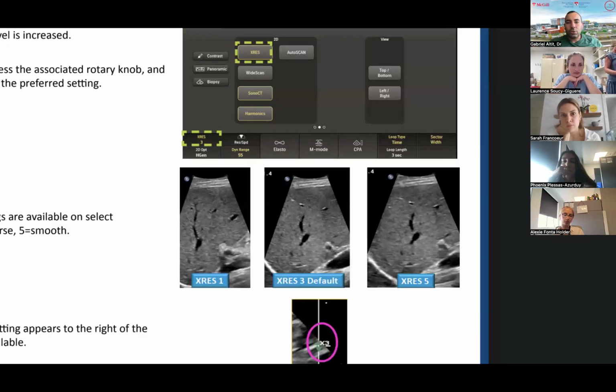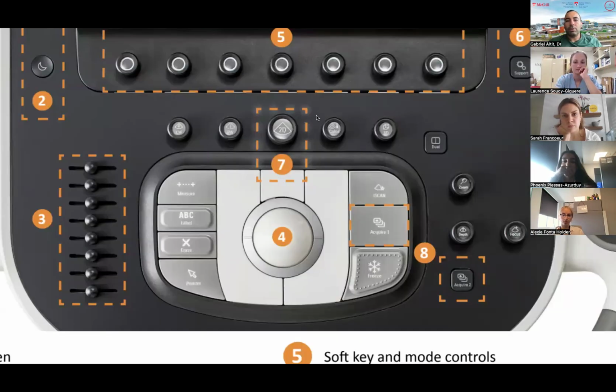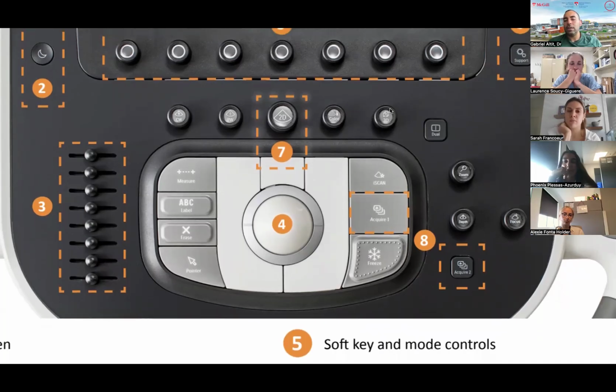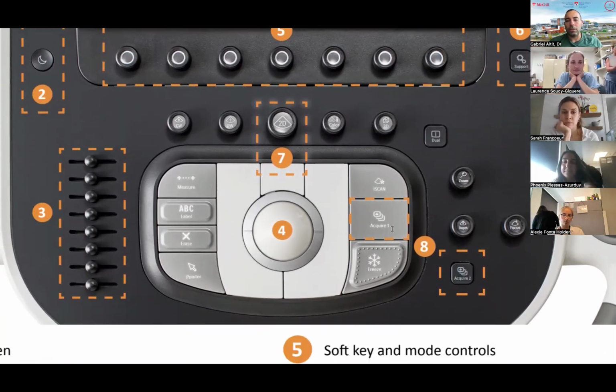So let's go back. We spoke about continuous wave Doppler, pulse wave Doppler. Color, as you know by convention, blue is away from the probe, red is towards the probe. 3D is only when you use an X probe, either the X7 or the X5. X5 for more adults, X7 for pediatrics. It's mostly to obtain volumes that we do that because we're looking at the functional parts. In the congenital ward, they're going to use a lot of that for the valvular anatomy, but that's not what we do in our field.